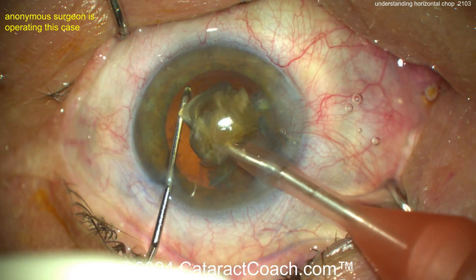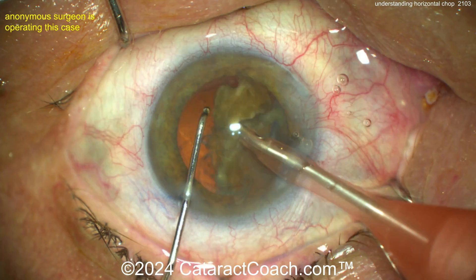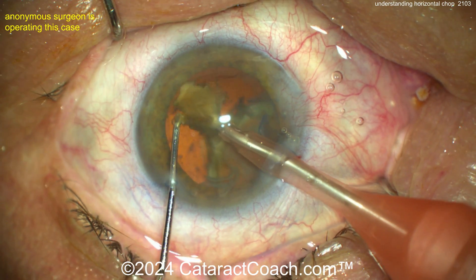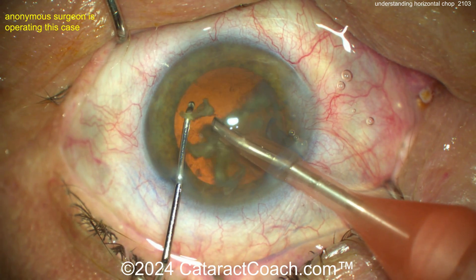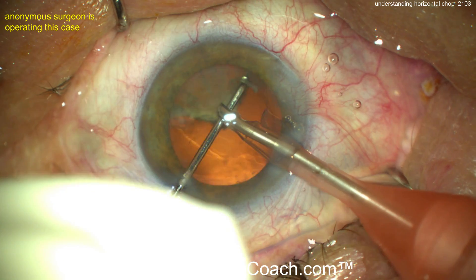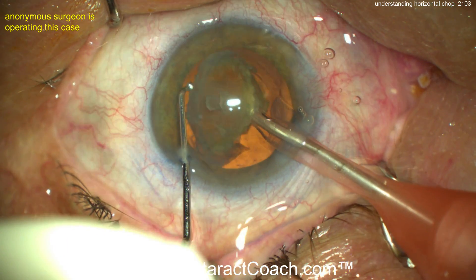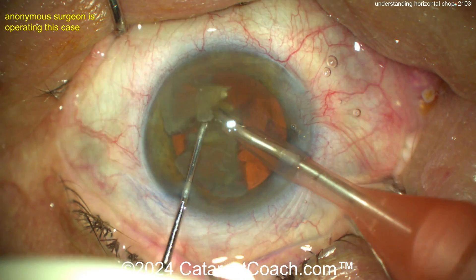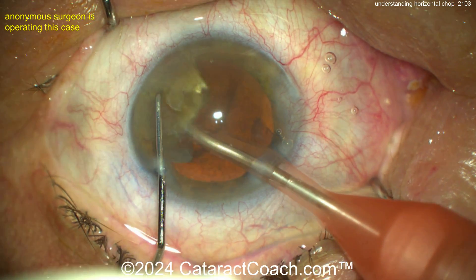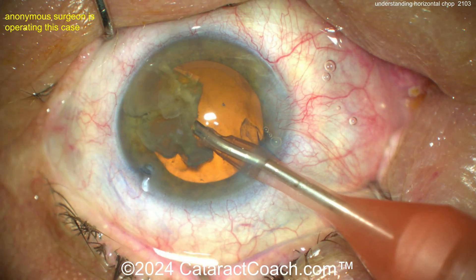Think about it: horizontal chop — the chopper is moving horizontally, parallel to the iris. The phaco probe holds the nucleus, the chopper goes around the equator, moving from the equator of the capsular bag towards the phaco tip. Then the phaco and the chopper are pulled apart to split it. The chopping action is horizontal, again parallel to the iris plane.